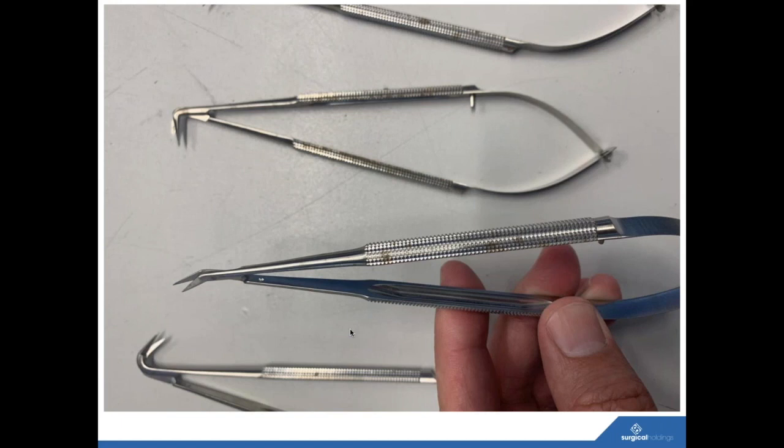And these are some of your most expensive instruments as well. So it's really important to pay close attention to those grooves and serrations on the instruments. Yeah, sure, these are really high-end devices. There's no question of the quality of the steel, but the nature of the design leaves these quite tricky knurls, and I should imagine it's quite a challenge to ensure they're clean, but also a challenge to pick up when you might have some bioburden retained in them, or indeed to check that they're completely dry after reprocessing and sterilisation.